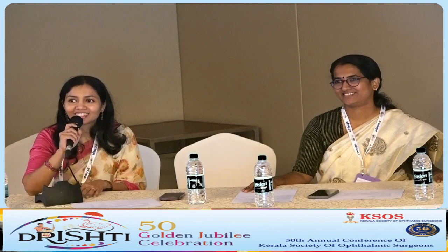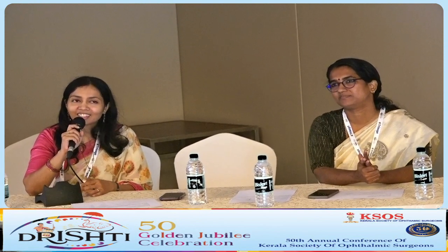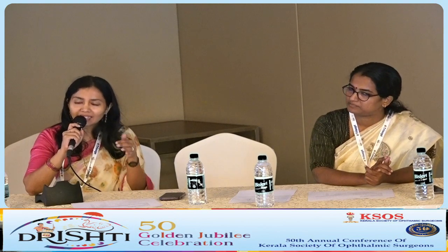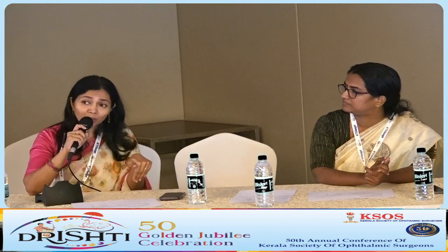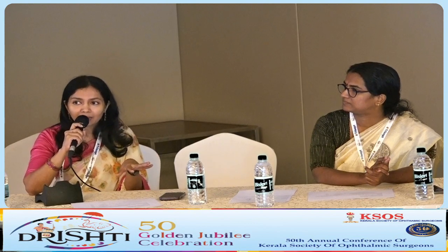How would you order OCT in a case with suspected papilledema? Actually, not all the cases are showing positivity, but still we can do the raster through the disc at initial presentation. Whenever the patient presents to us, we do it initially itself. And what we have noted is that the tilting away from the vitreous, which is seen in normal, is altered even in early papilledema.